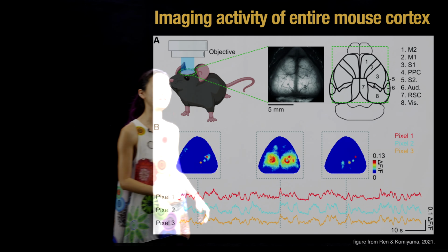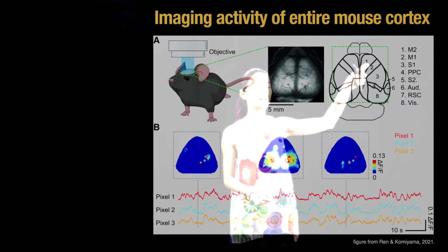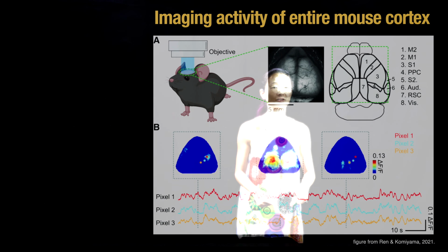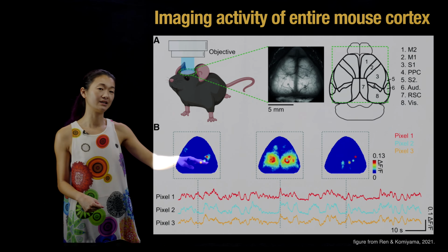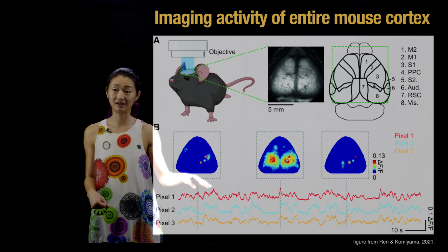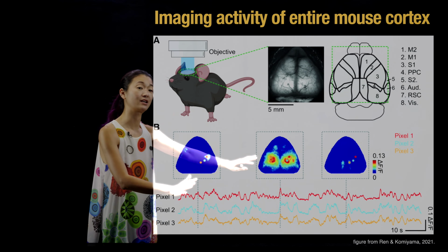And so what you're seeing here is a dorsal view, the top-down view of a mouse brain, annotated by the different brain areas. These two bulby things up here are the olfactory bulbs. We're not imaging them, but you can actually image the olfactory bulbs. In this experiment, they're not. And what you get out of it is a movie of delta F over F, the calcium activity that is correlated with neural activity of everything that's going on in the entire brain.